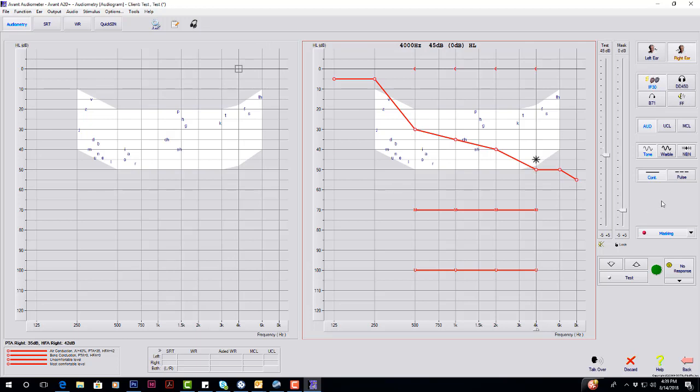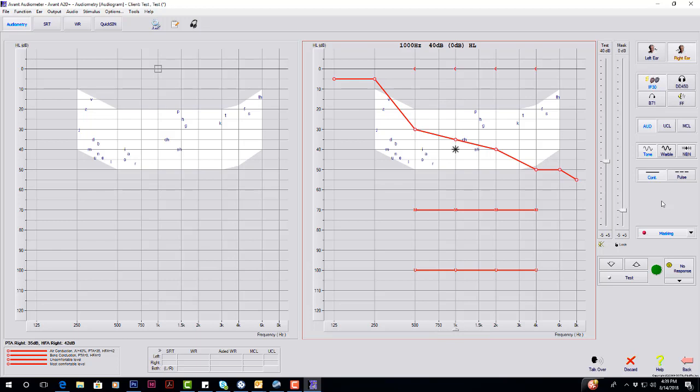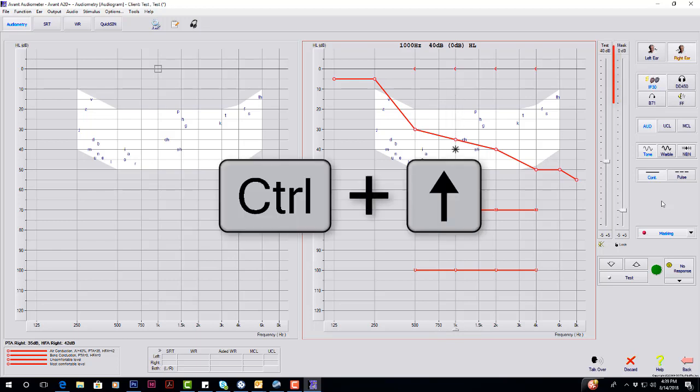To change your masking, the up and down arrow keys change your hearing level, and left and right change your frequency. For masking, you can hold control and change your dB level or hearing level of the masking.